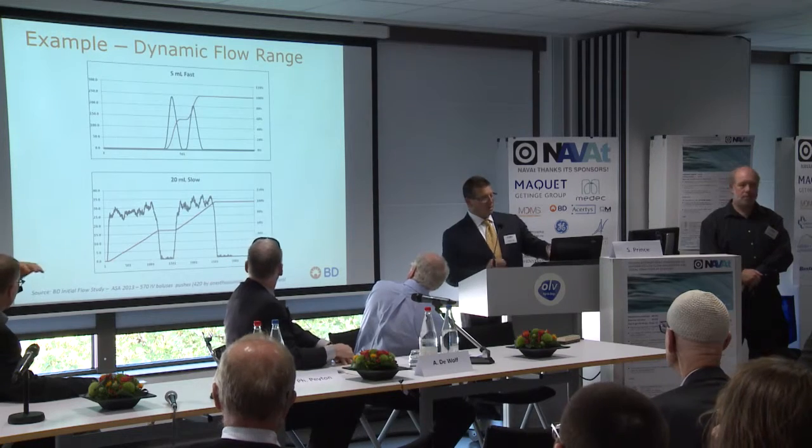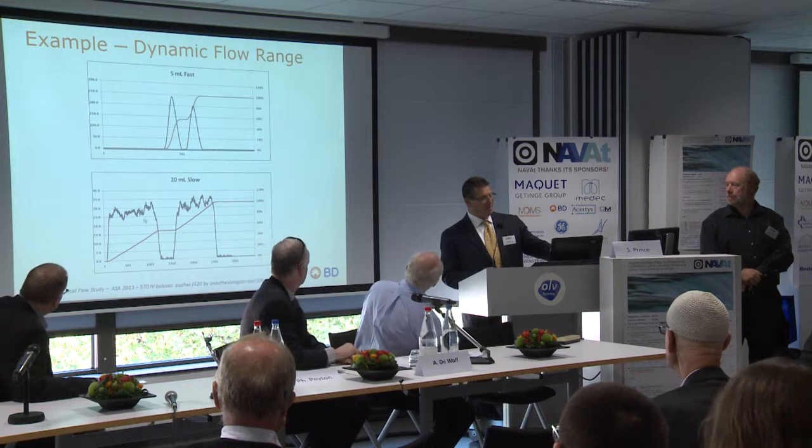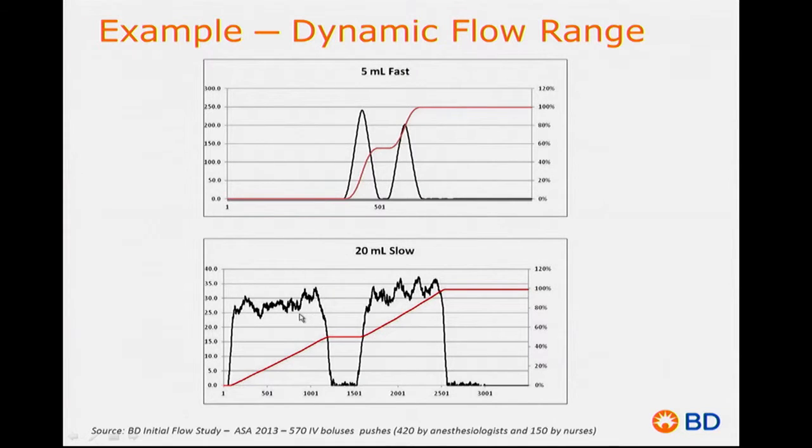You had a flow diagram that had a lot of noise with it on one of the slides. Was that a person with tremor or noise on your sensor? That one. Go back. Another one. That one. The one on the bottom. This is actually a diagram of an anesthesiologist syringe push. No, I know. But yeah. I'm saying, did that guy have a tremor, or is that your sensor having noise on it?